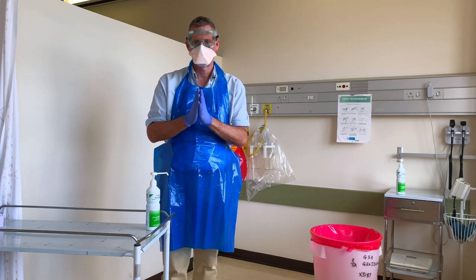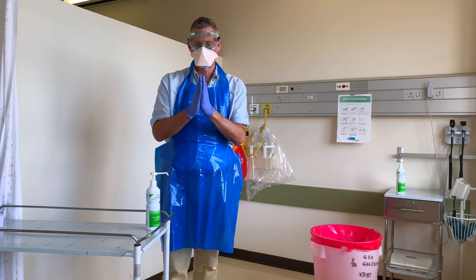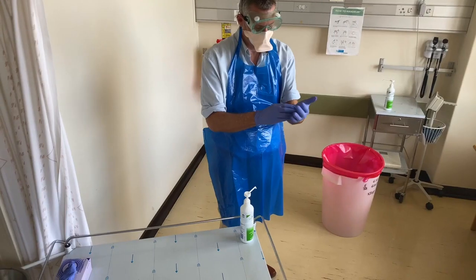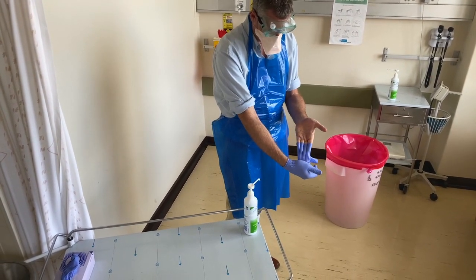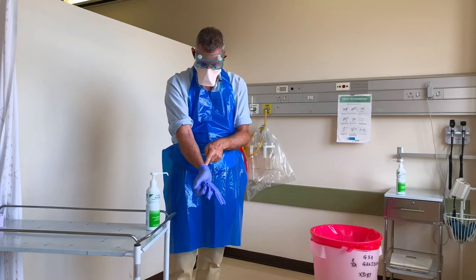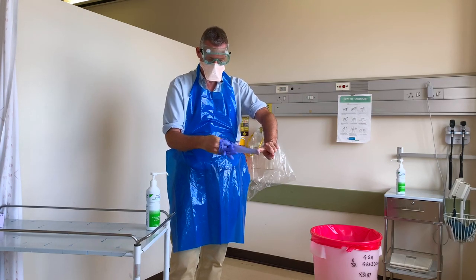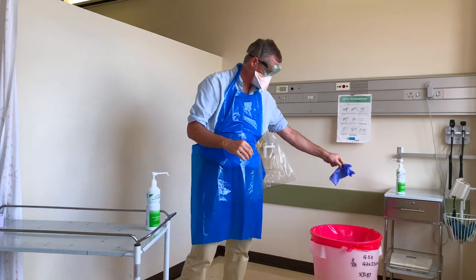The first thing we're going to do is take off the gloves, because of all this equipment the gloves are the most likely to be the most heavily contaminated. I'm going to peel off the first glove, exposing the non-contaminated surface, and then for the second glove I place my finger underneath into the non-contaminated part and just bring it through. This is now uncontaminated and I place it in the bin.